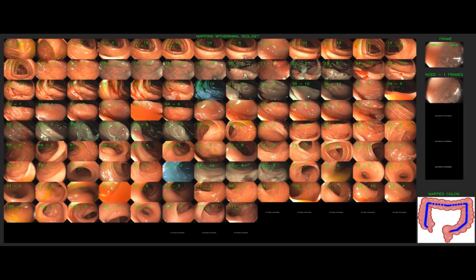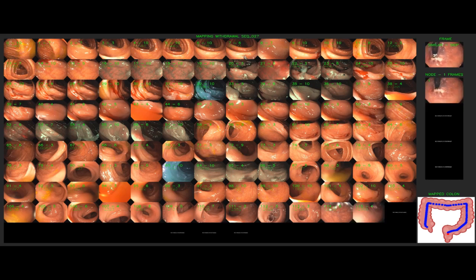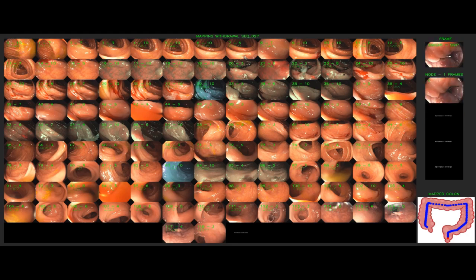We are able to build a topological map, covering the whole colon, being the first work in the literature able to process a full global map from a full colonoscopy video. Later, this map will be used to localize another sequence of the same patient. But first, we need to talk about how we find covisibility between images.